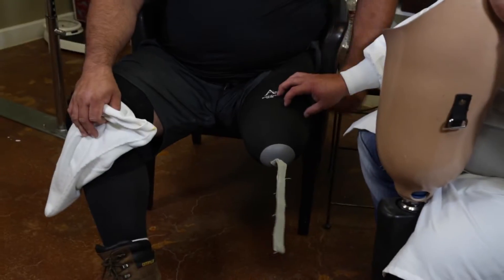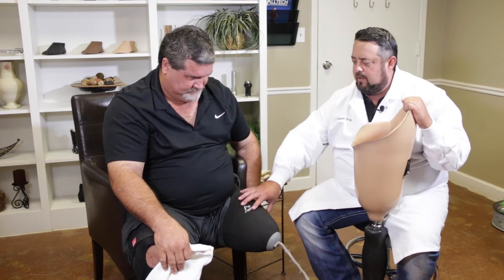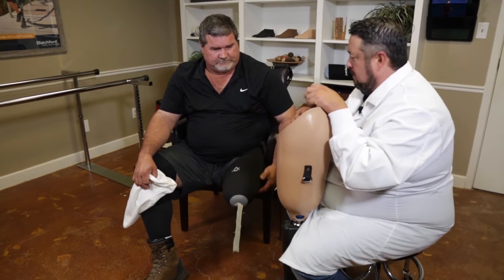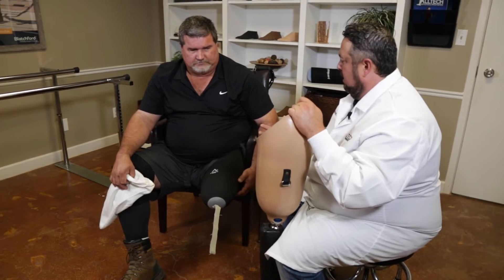Ninety-five percent of all amputees wear some kind of silicone liner now. Over the silicone liner, sometimes as the residual limb starts to shrink — the longer you wear a prosthetic, you're confined in this prosthetic socket — your residual limb is going to shrink, and as it starts to shrink, we're going to create room inside of the socket, so it's going to be like buying a shoe that's too big.